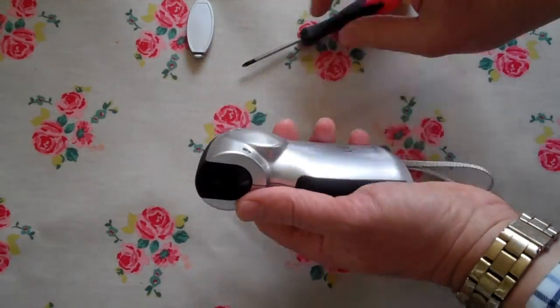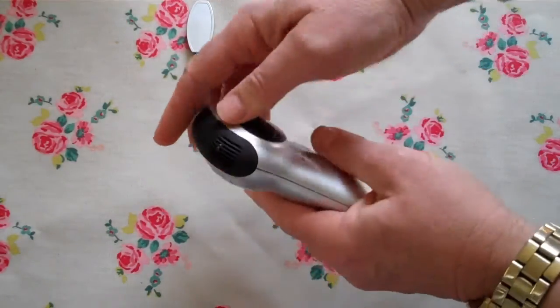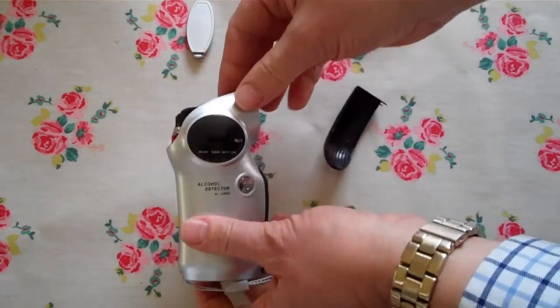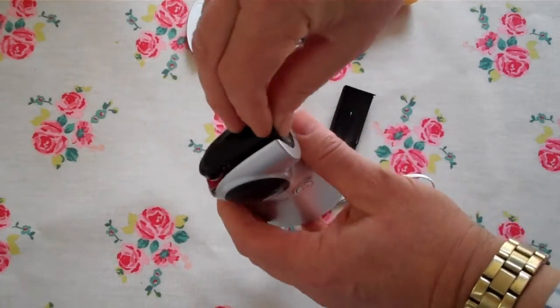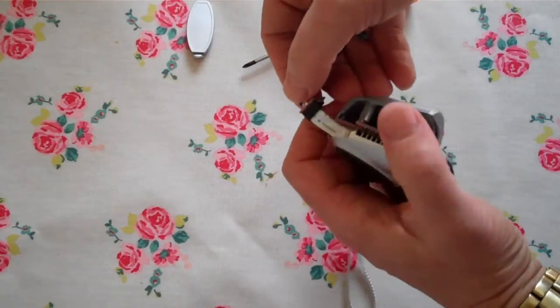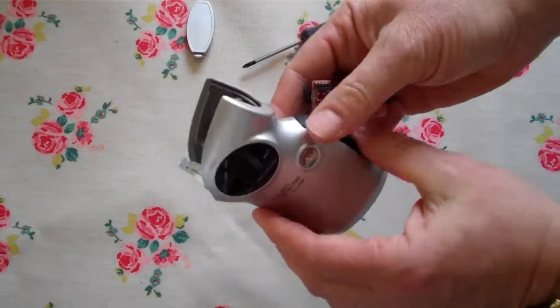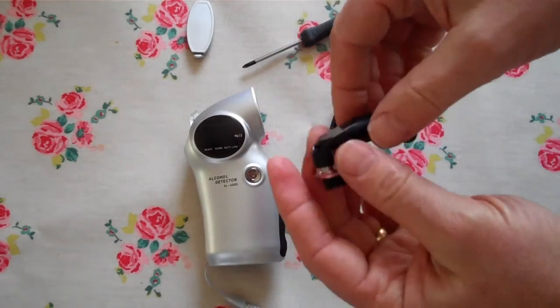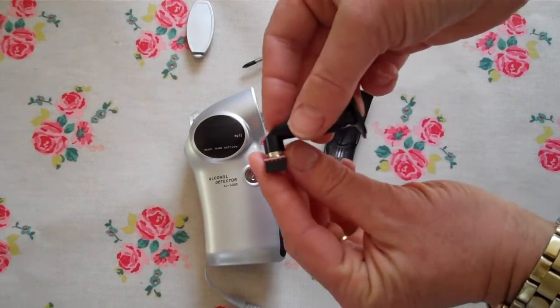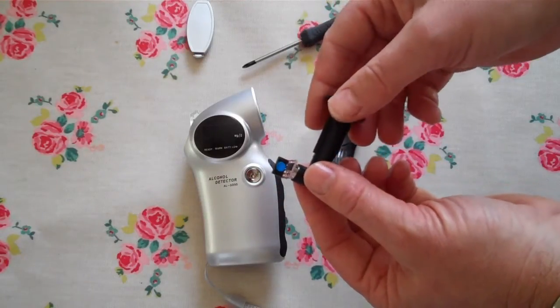On the reverse of the unit, unscrewing that screw will allow you to open the unit up. Go around to the back of the unit to clip out the top element of the breathalyzer, and you'll see the sensor — it feeds out from the unit on pins. This is the breathalyzer, this is the sensor, this is the cover that goes onto it. On this particular model, the blue spot indicates a milligrams per litre sensor.